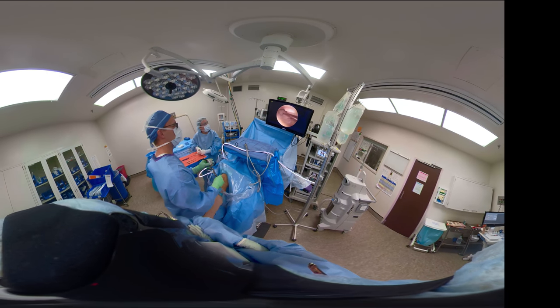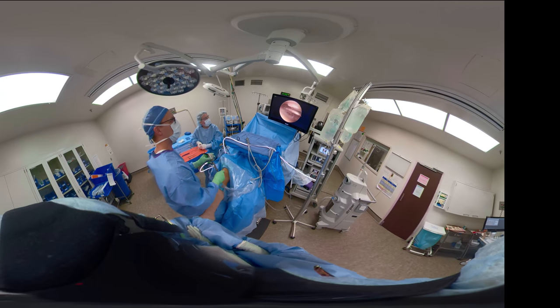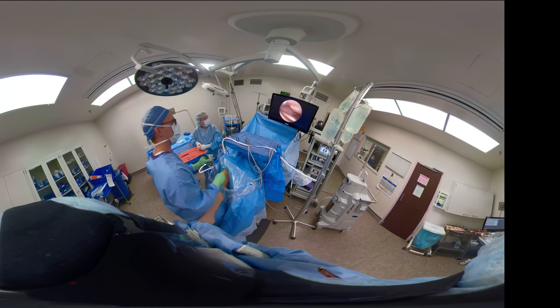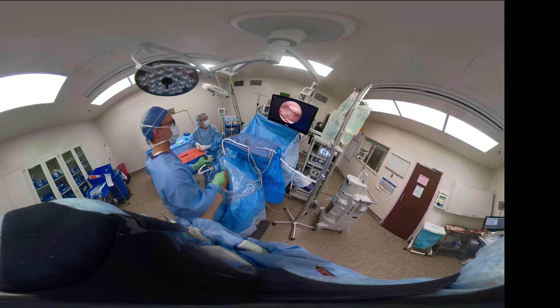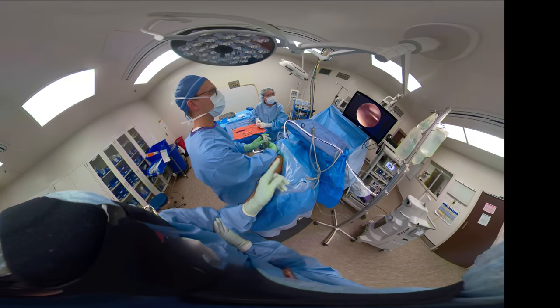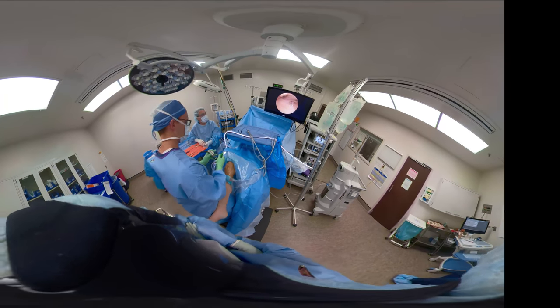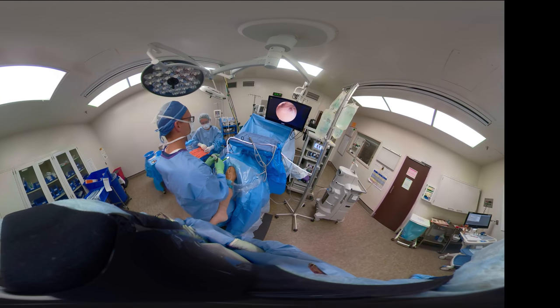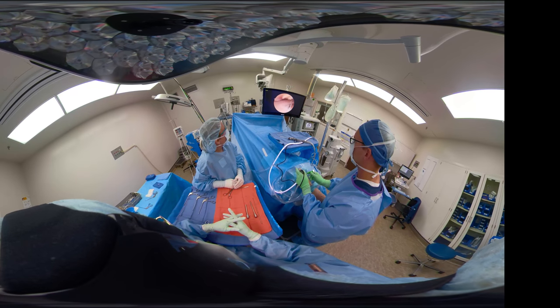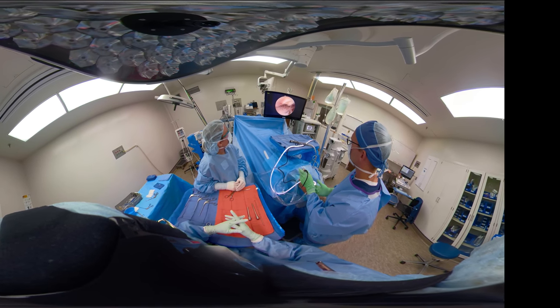So now we have the scope, and we're looking for what the lesion is. And you can see the resident has the arthroscope, and we're leaning into a varus position to be able to get into the lateral portal. The scope is lateral in this right knee. Looking at the lateral meniscus. Lateral meniscus has a little fraying, but the main problem here is his osteochondral fracture of his lateral femoral condyle.